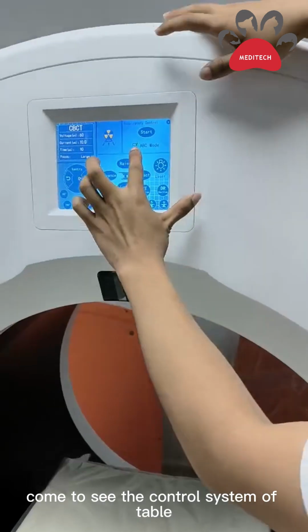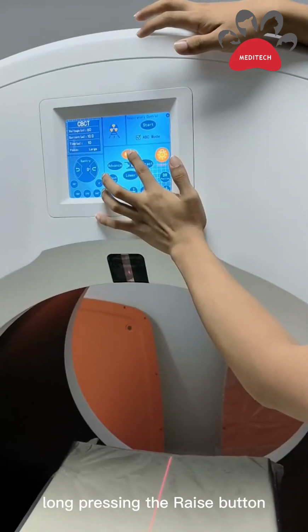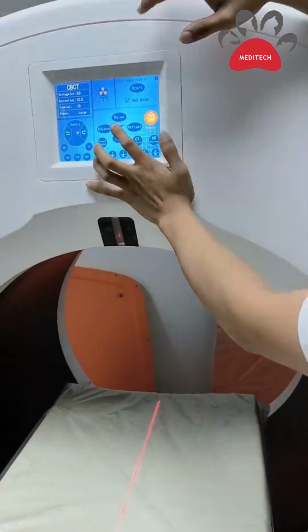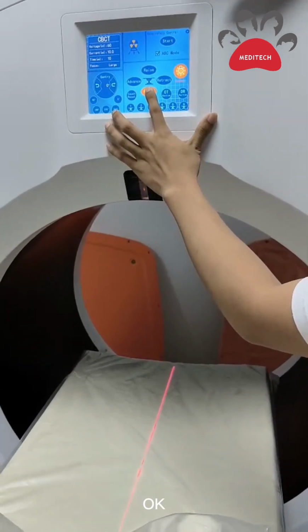Well, come to see the control system of the table. Raise the table. Long pressing the raise button. See the table is slowly rising up. Long press lower to lower the table. OK.